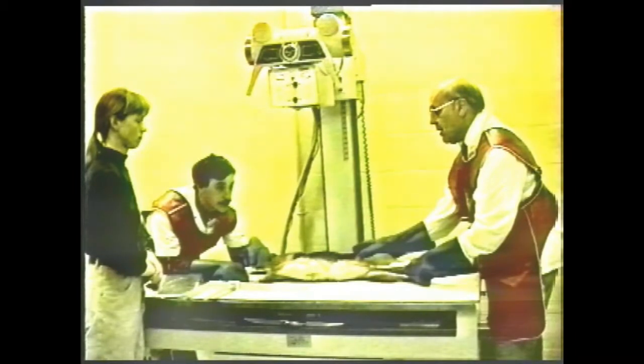As we demonstrate the thoracic positioning, you will notice that this is the first time that we have shown manual positioning rather than the chemical restraint that we have shown previously using positioning devices and tapes. If possible, it is always better to use the chemical restraint rather than the manual restraint, since it allows the operators to be completely out of the room and free from the radiation exposure.